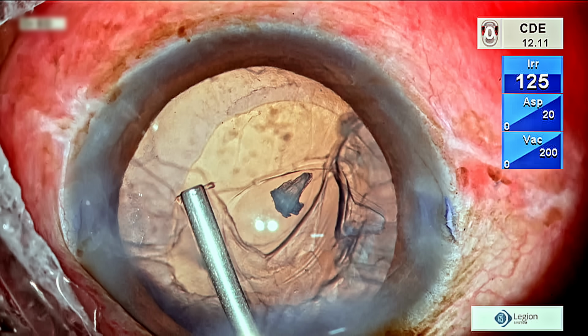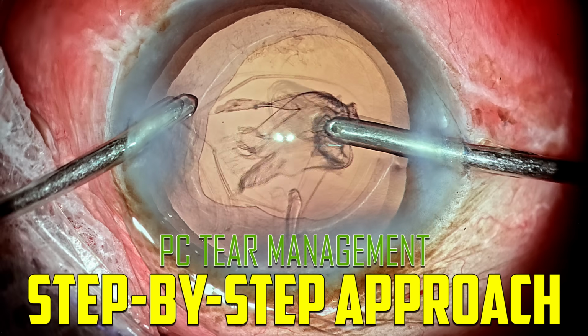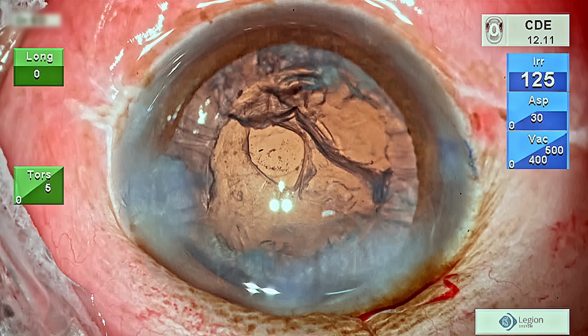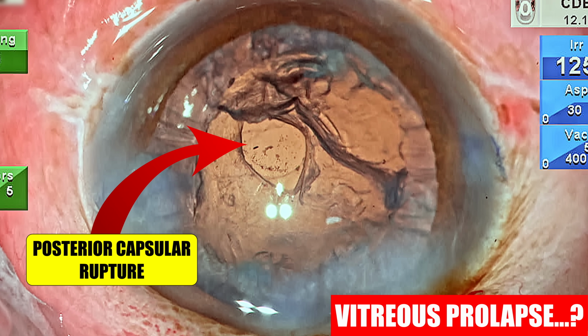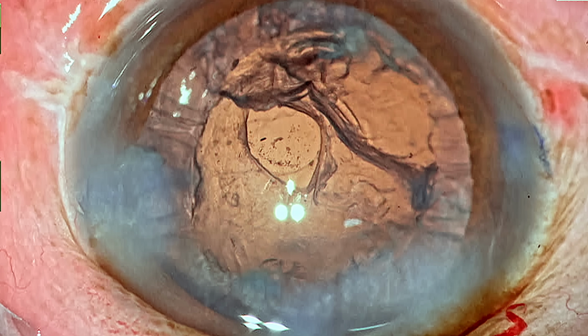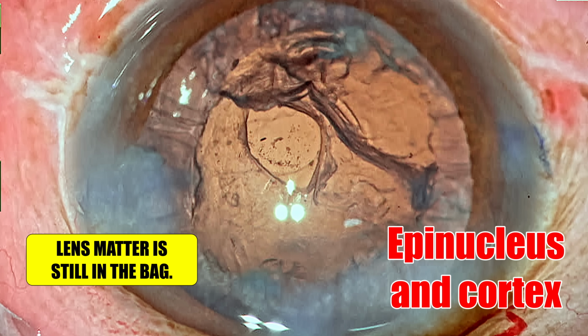Hi, this video is a tutorial on how to approach a case of a PC tear in a step-by-step manner. The scenario now is that we have a posterior capsule tear. We're not sure whether vitreous has prolapsed out. We still have a lot of lens matter in the capsule bag, maybe epinucleus and a very large sheet of cortex.